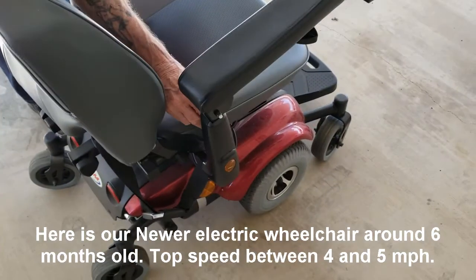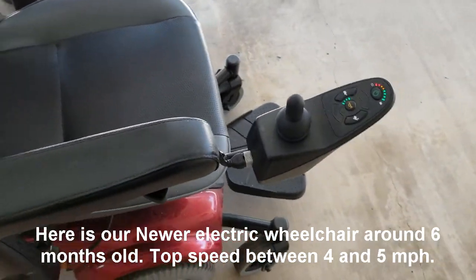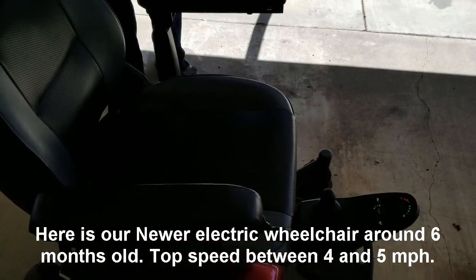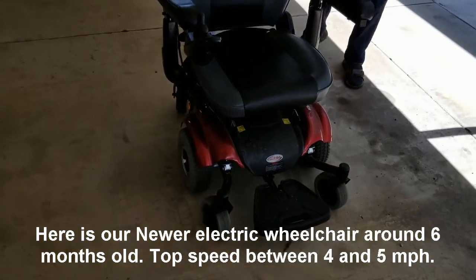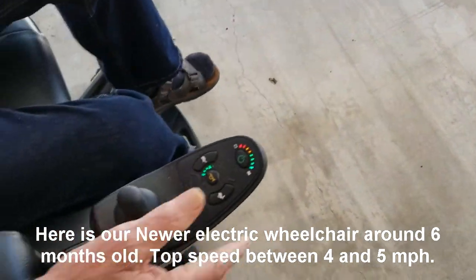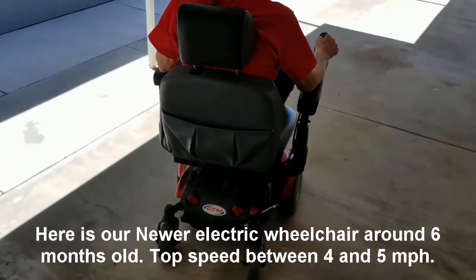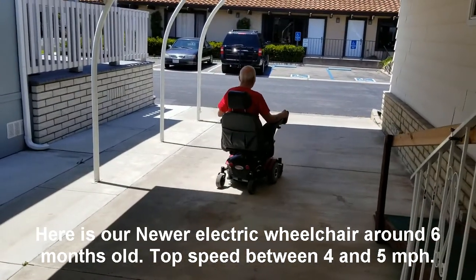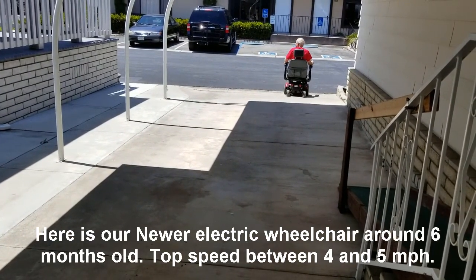This has been used primarily for the outdoors, although it could be used indoors as well. But this one has a top speed of around 4.5 to 5 miles an hour. So we're going to demonstrate that now — I'm going to have somebody sit in the electric chair and show its top speed. He just went 30 feet in a few seconds.